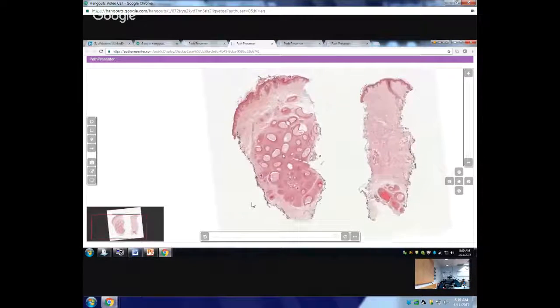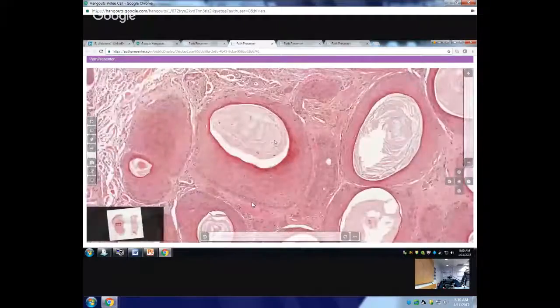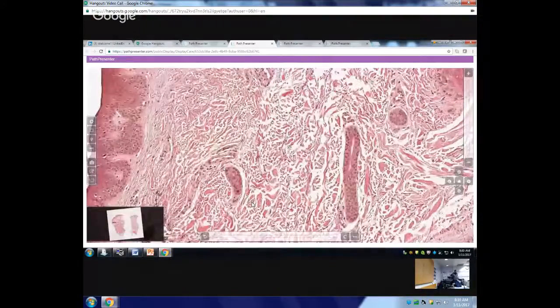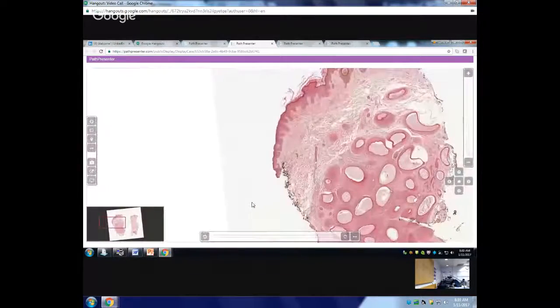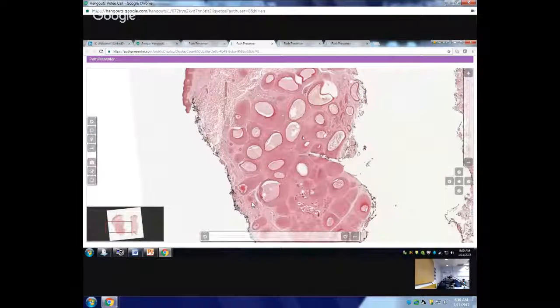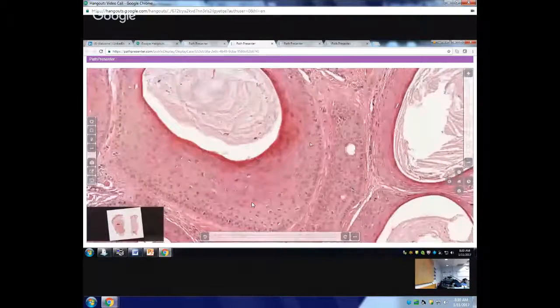So, the same collection of glandular-like structures in the dermis on low power. When you go high power and you look at the lining, look at this lining and then go back to the epidermis. And look at this epidermis. Very, very similar lining. It's almost like the epidermis is encircling this follicle, but they are composed of this glandular structure. So this is a trichoadenoma. And then you can always imagine all these spectacles or owl's eyes. So these are like a spectacle. So trichoadenoma.